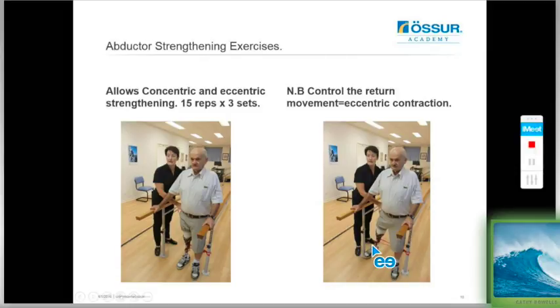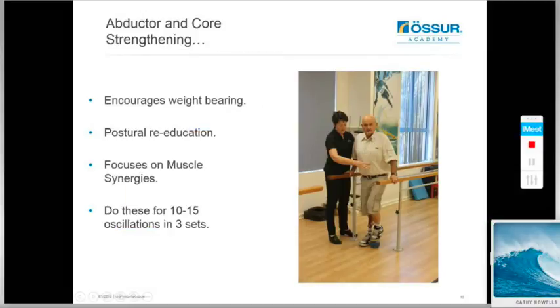It's really not the pushing out. It's going to be the control on the way back in. And usually you'll find they're much worse at controlling that contraction as the leg tracks back in towards the intact side.